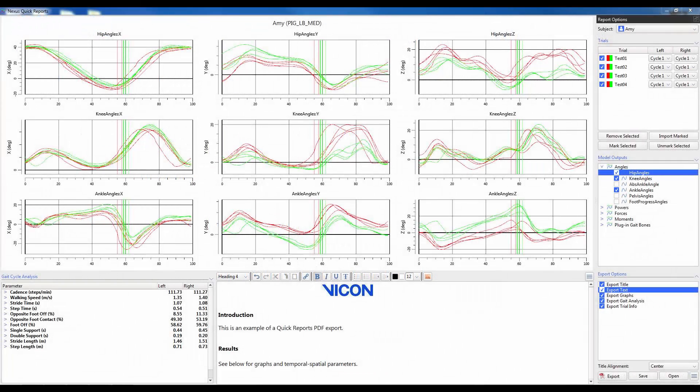Quick reports is a feature that was first introduced into Nexus 2.6. It provides the user with an easy and intuitive way to view multiple model outputs across one or more trials with the option of normalizing the data to individual gait cycles or comparing across the entire trial. This is supplemented with the inclusion of temporal spatial gait cycle parameter calculations and a text window which can be used for more in-depth discussion.